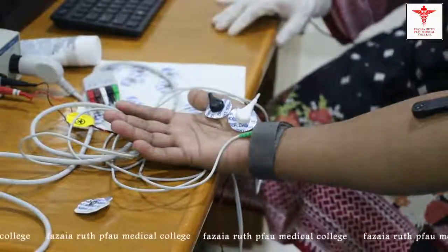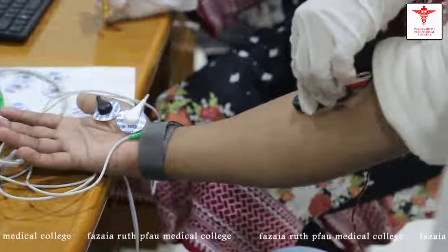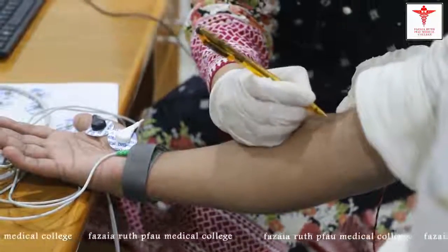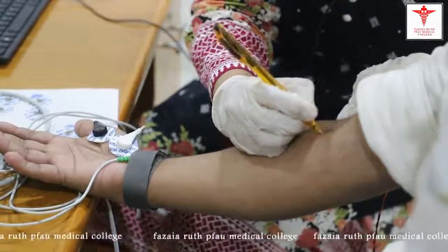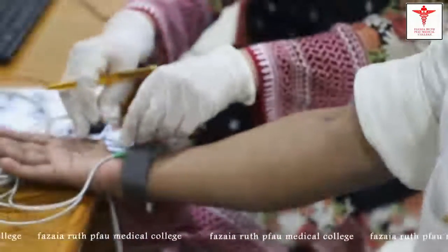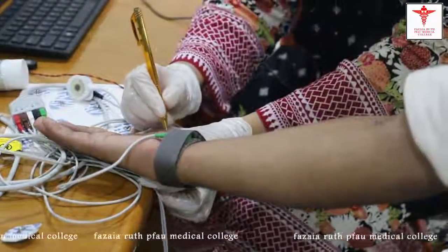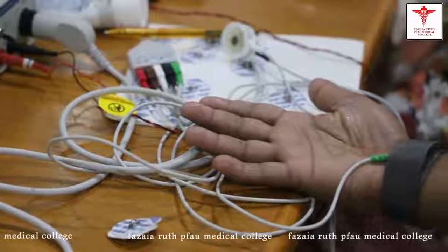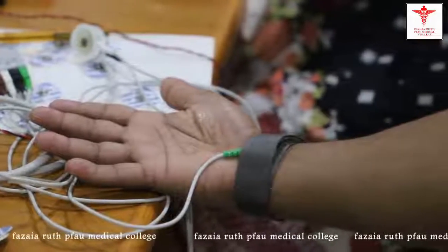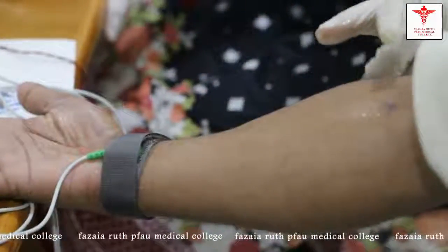Now remove the stimulus electrode and mark with a pen on the indentation. Remove the other electrodes and also mark here. Now students, we will measure and record the distance between the marks at the elbow and at the wrist. This is the distance between the stimulation sites.